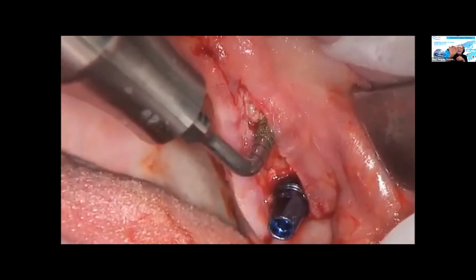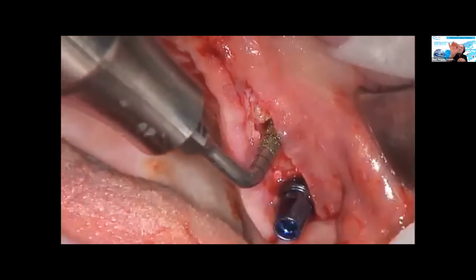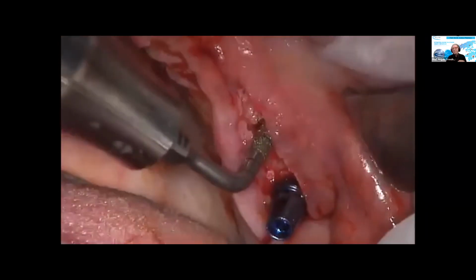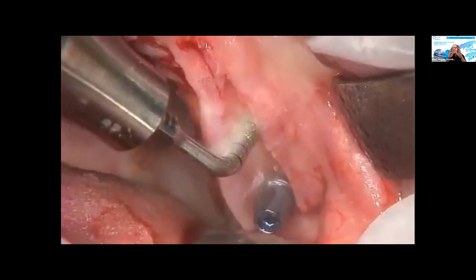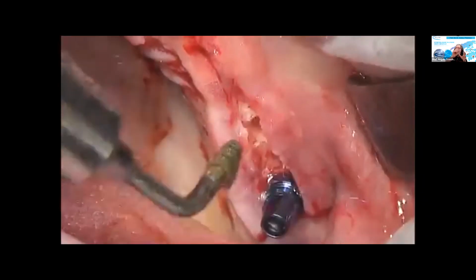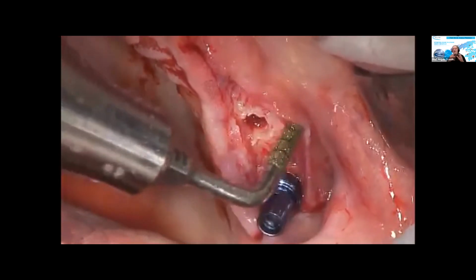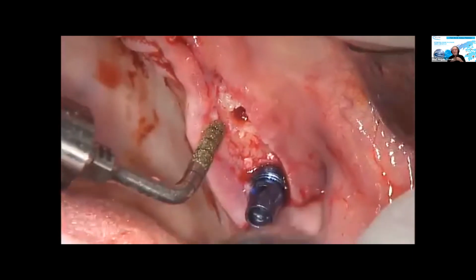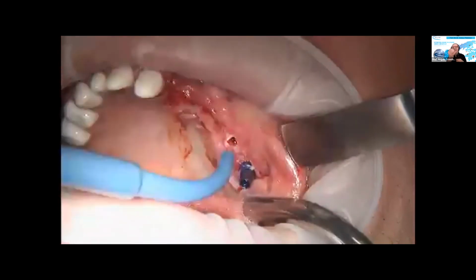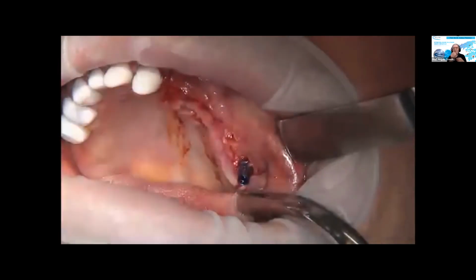Now, as you can see, in the marking position of the mesial implant, we did now some initial drilling to be a little bit faster, because you don't have to worry. The sinus membrane is already separated from the sinus floor. So even if you drill until the sinus floor, chances are low that you might have a perforation. But I always want to stay on the safe side. Why not taking this 1 single minute or maybe 30 seconds to once again open the sinus floor with the diamond-coated drill?